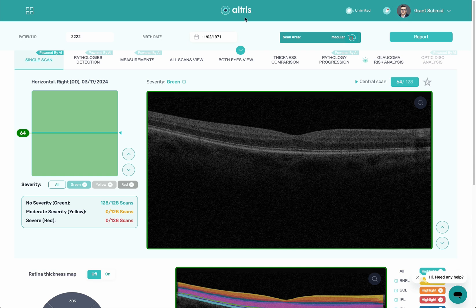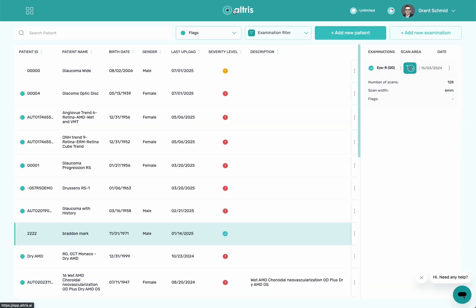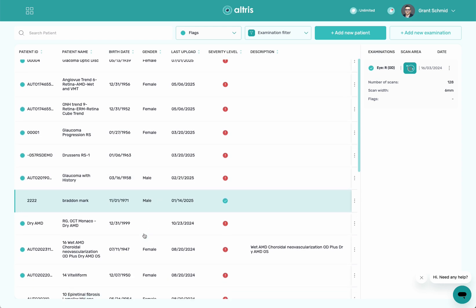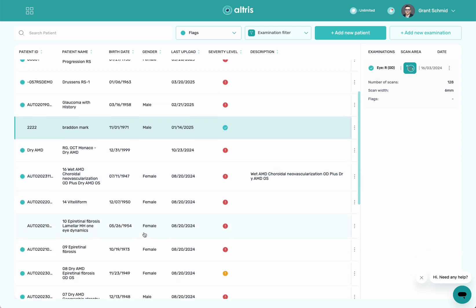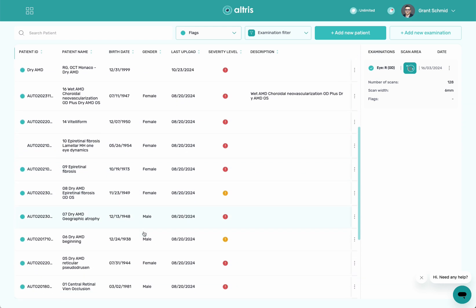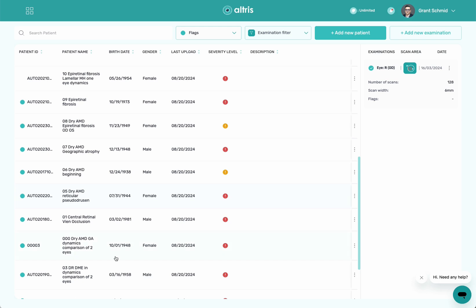This ALTRUS logo is always my home button. Whenever I'm in any patient, I can click here and it'll take me back to the main screen. From this point I can grab a patient that does have pathology, so I'm going to scroll down here and grab another patient.